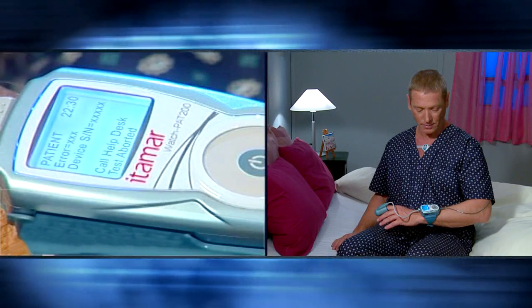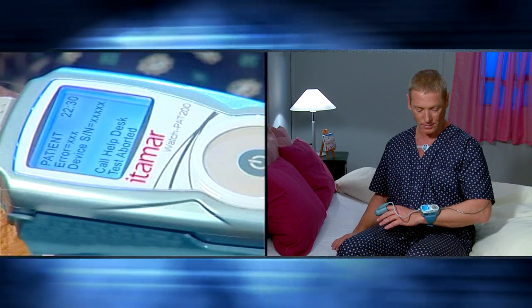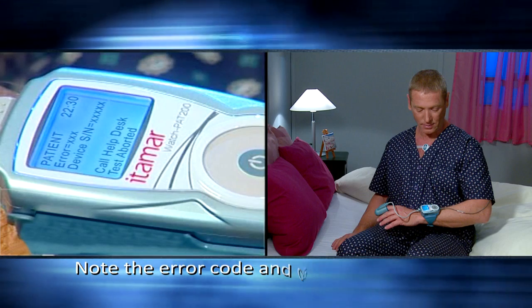If there is a problem, you will see 'Test Aborted'. In that case, note the error code and call the help desk.